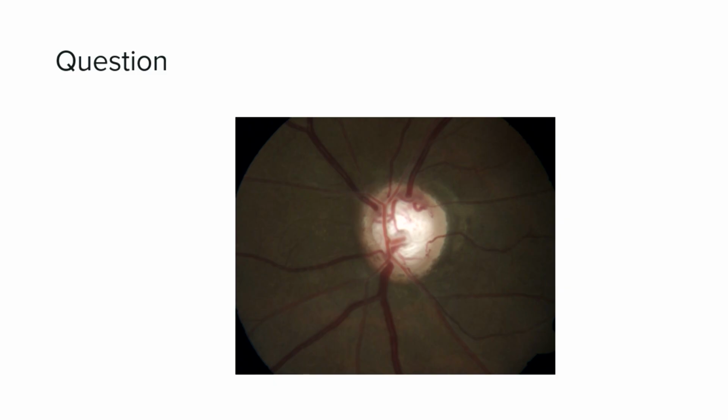There's bipolar thinning, no? Bipolar superior and inferior rims are thinned, with a cup disc ratio of 0.8, and there is peripapillary atrophy present, and there is no RNFLD, or this could be diffuse. There is no RNFLD, and probably diffuse loss is there. Diffuse loss can be there without any disc hemorrhages.